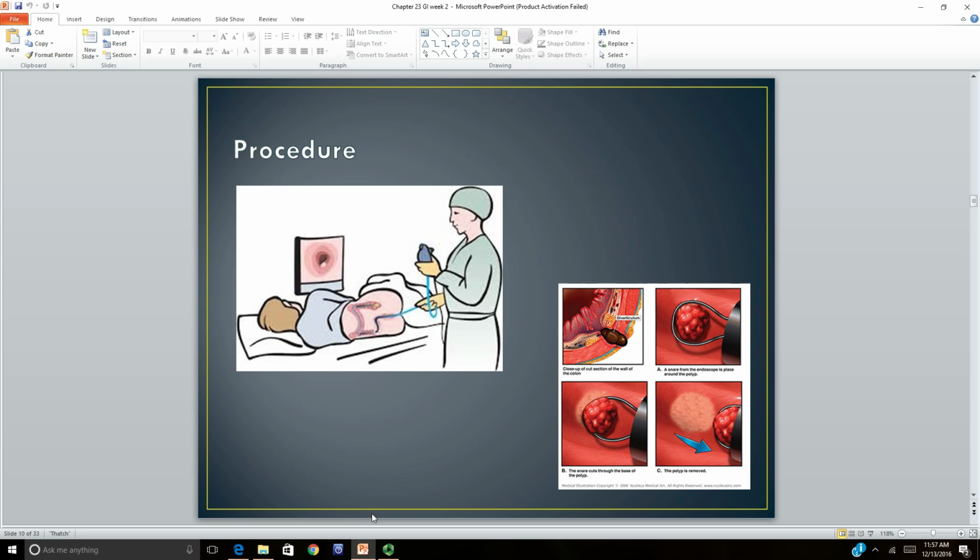The patient is usually in the left lateral position and should be covered with warm blankets, with only the backside exposed. The scope is lubricated with gel and inserted slowly into the anus. Once the proximal colon is in view, the doctor will begin to withdraw the scope while examining the mucosa. Air may be pumped into the colon, which may cause the patient some discomfort. Photos are taken of any suspicious tissue, and suction and irrigation is controlled at the scope head.